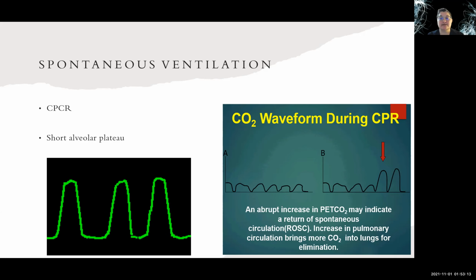The alveolar plateau, or phase 3, this is actually going to be shortened. It's not really going to be flat. It's going to be kind of rounded.